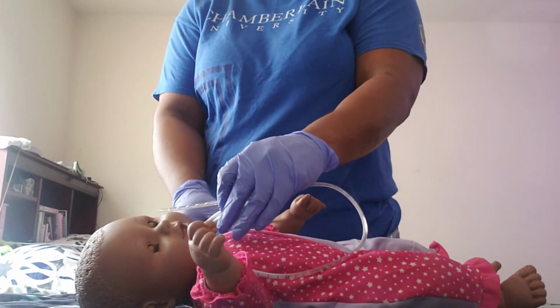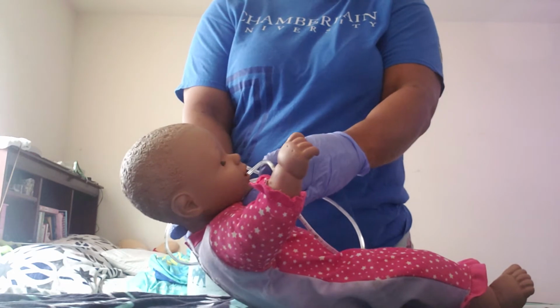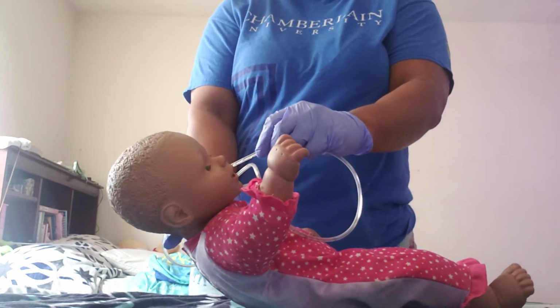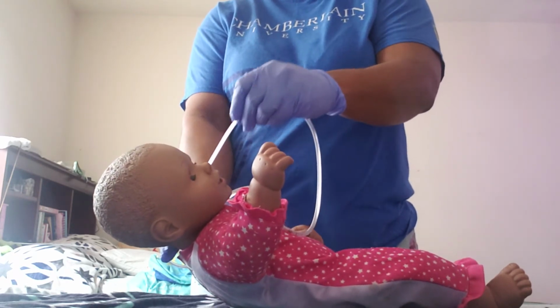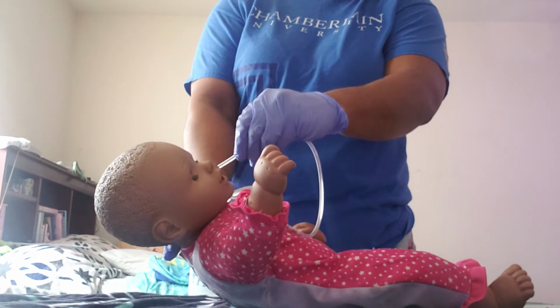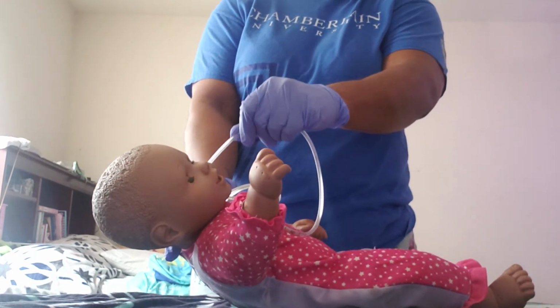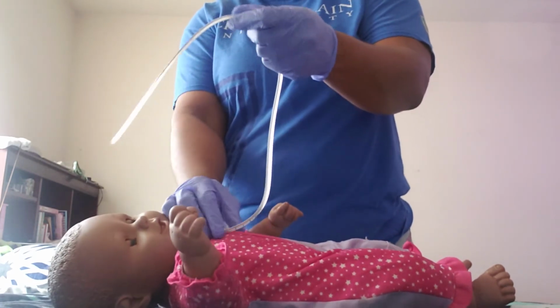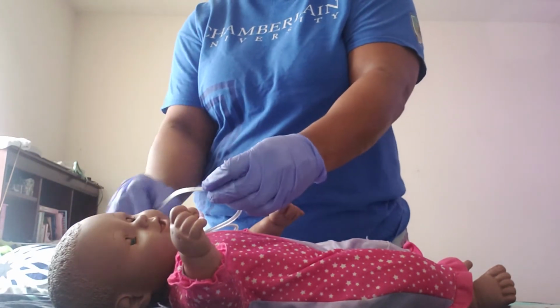Once I get there, I'll have the patient tuck in his chin, and I will continue to have him swallow. Every time he swallows, I will gently insert the NG tube slowly into the patient until I get to the marked number of insertion.